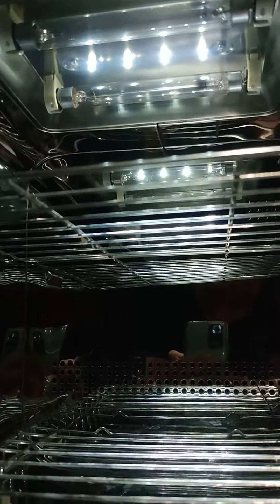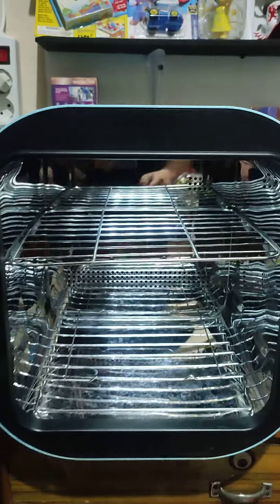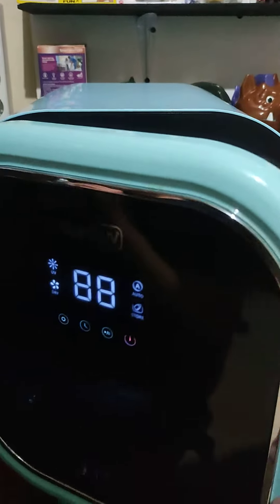Lampunya nyala, lampu UV-nya ada dua. Ini kayaknya sensor di engsel kena, tapi masih normal.